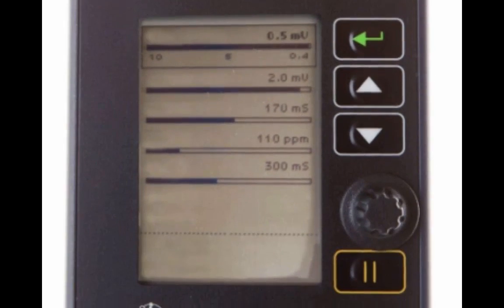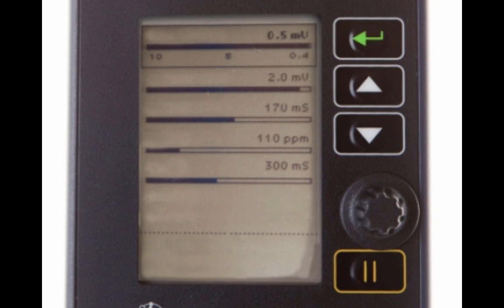Moving on down to the lower screen, you'll see a number of menus pop up. And using the directional arrows, you can scroll through to select one of the menus. And to actually get into that menu area, you'll use that green button there. And to change parameters, you'll use this dial.